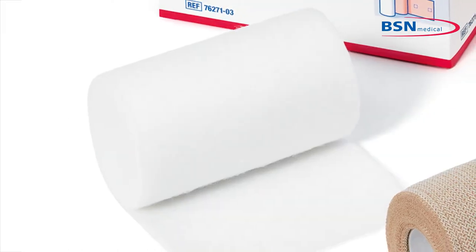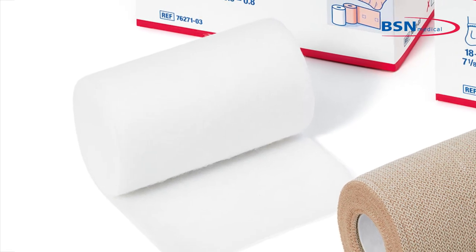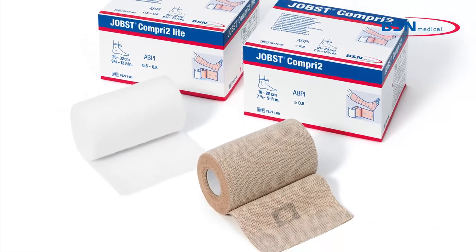Before beginning, be sure that the patient has no contraindications that would prohibit the use of Jobst Comprie II. Also confirm that the correct product variant and size have been chosen.